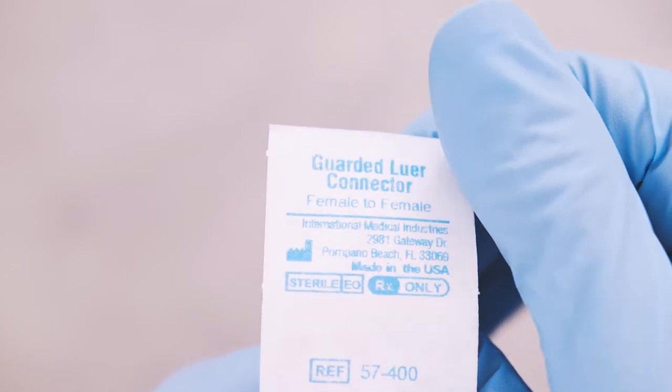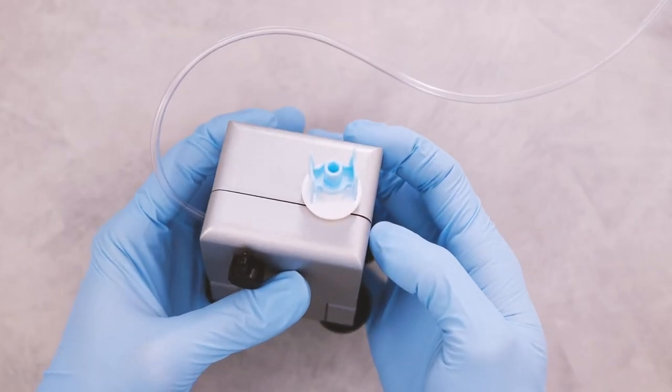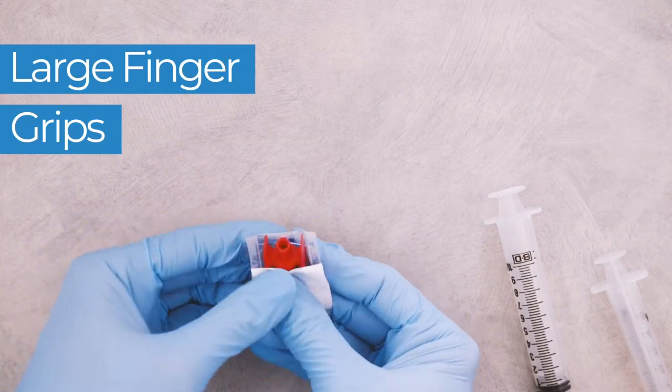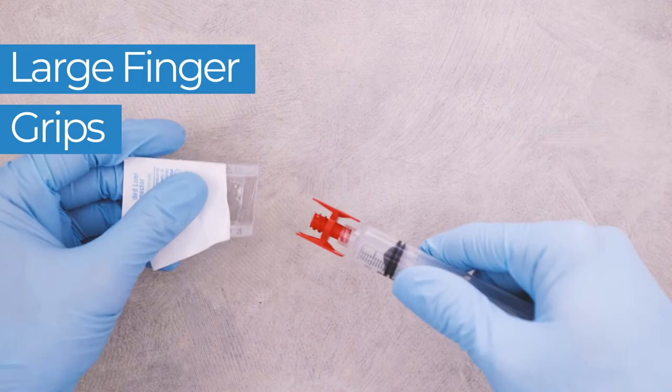Guarded Luer Connectors feature select enhancements that make them a premier choice for pharmacy operations. Large finger grips provide secure manipulation and help protect against touch contamination.